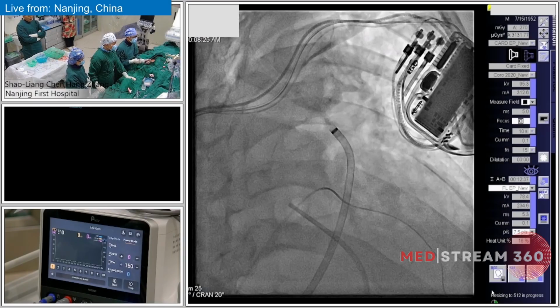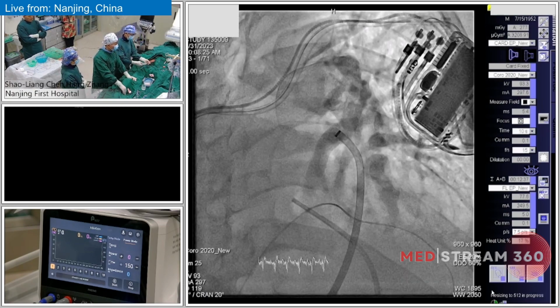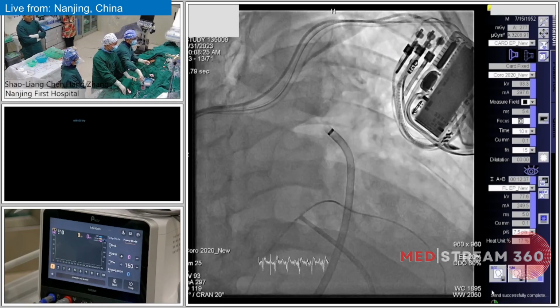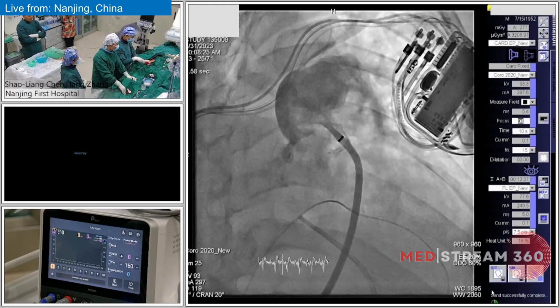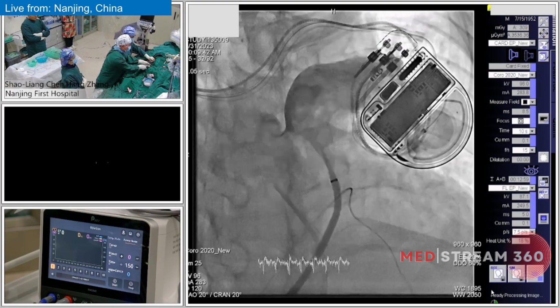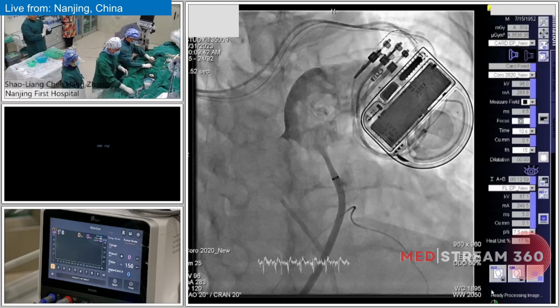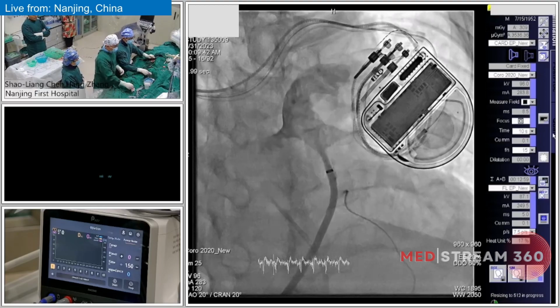Thanks. So I will go backward a little bit to see how to define the procedure of pulmonary artery denervation, PADN. Very clearly, the patient has a long history of heart failure. Cardiac echo confirmed the significant reduction of the left ventricular ejection fraction. Now you can see the angiography for the pulmonary artery using the large long sheath. The sheath tip is just above the level of the pulmonary valve, directly facing the ostium of the left branch.